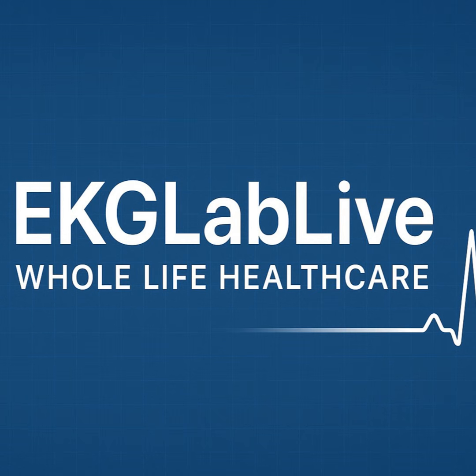Oh, wow. Yeah, the electrical recovery on your screen does not equal immediate mechanical recovery in the patient's chest. They may still have low cardiac output and experience shortness of breath for weeks while the muscle heals. That is wild. The electricity is back online, but the plumbing is still bruised. It completely challenges you to remember that a post-cardioversion strip, just because the jagged white lines look perfect again, doesn't mean the patient is fully stabilized.